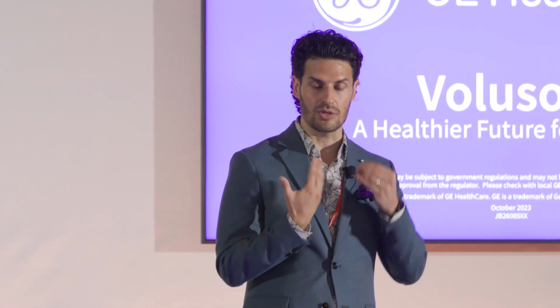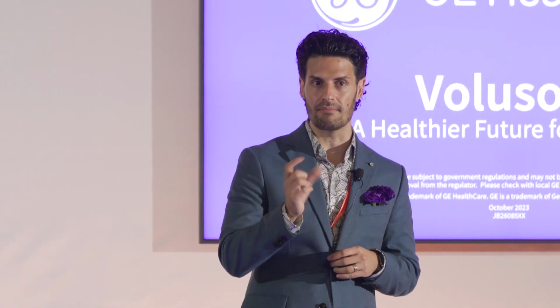But in real life, when we do sonohysterography, sometimes you need quite a bit more to get the distension, to get that tubal assessment complete. And I personally, anecdotally, do not find that the amount correlates to the pain. It's usually the beginning of the procedure when that becomes most uncomfortable for people. Thank you.